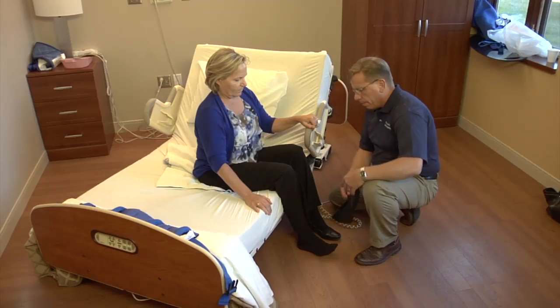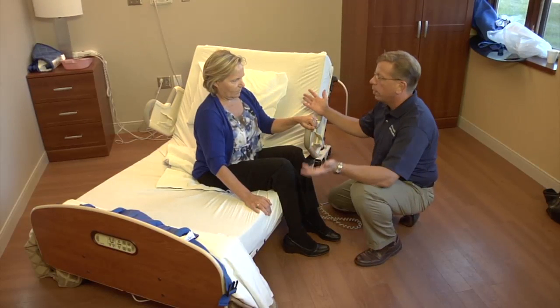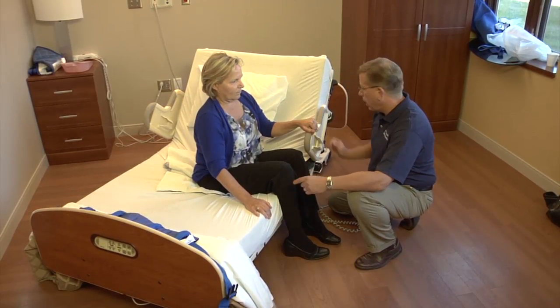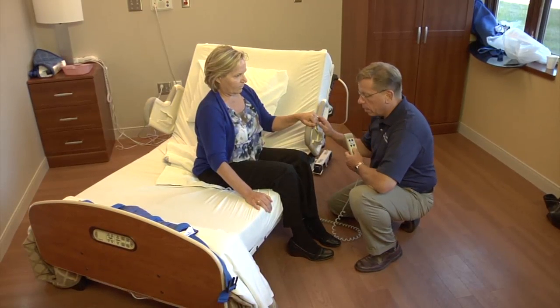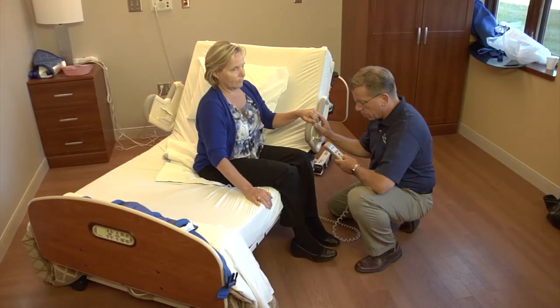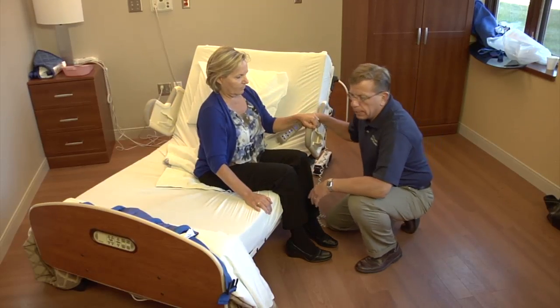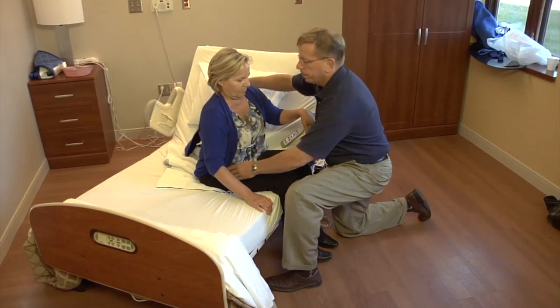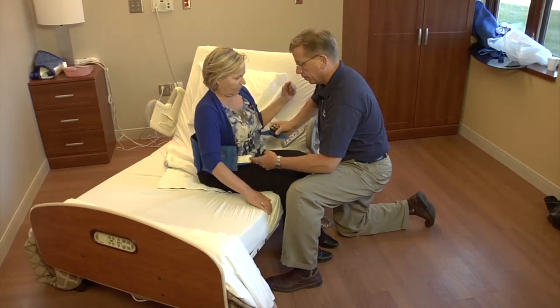Proper footwear is always key to helping that patient stay stable and up on their feet. Always use a gait belt if you're going to give any kind of contact guard to that patient. Unless they are independent, a gait belt should be on. The gait belt is not a lifting device. It's a device used to help cue and stabilize your patient. Worn low and around the center mass of the patient's body, it'll give a nice level of support for the caregiver with a safe place to put their hands.